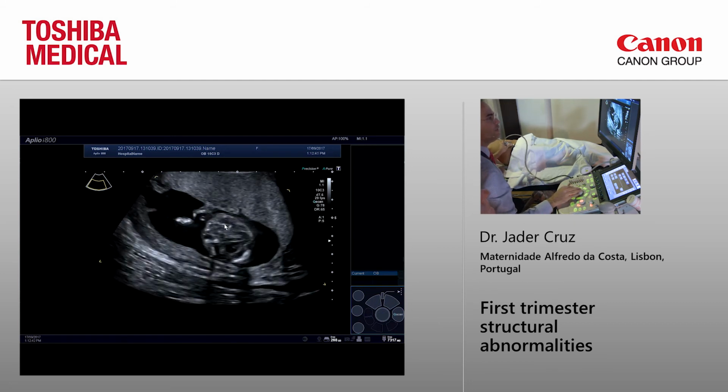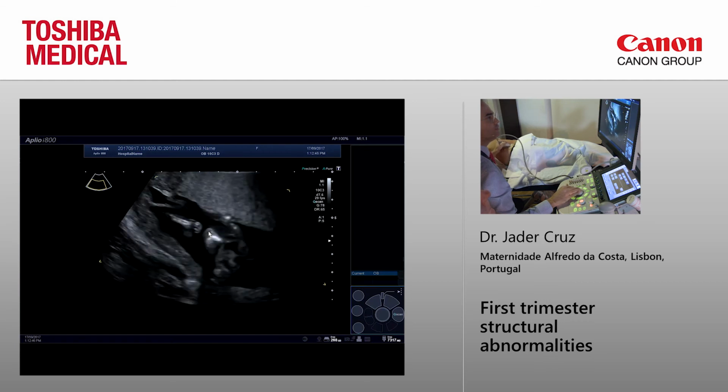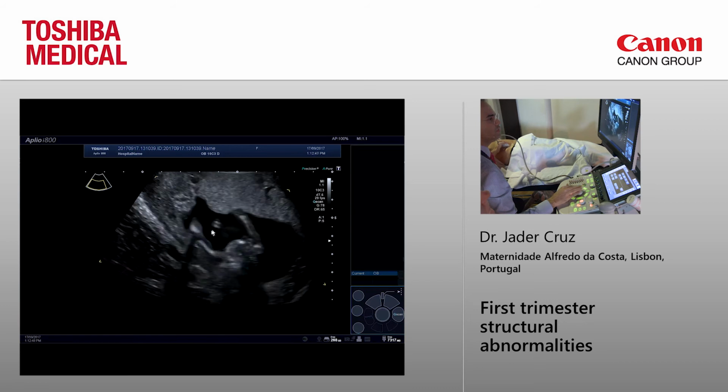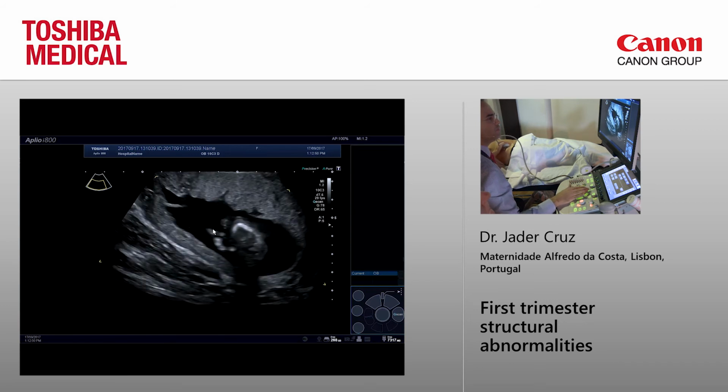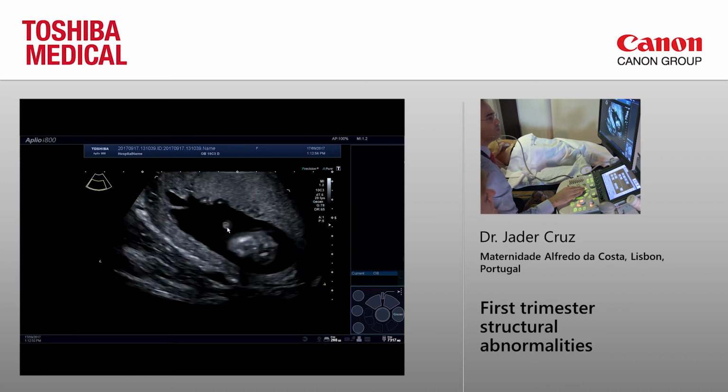We're going to the eyes, and then we move to the palate. Well, let's try to show you here if the baby remains in the same position or not. That's live scan. That's why it's called live scan.